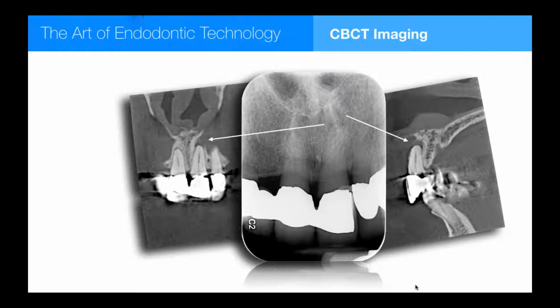Most of our patients now are having their orthodontics without 4x extraction to get that beautiful full arch form. It looks great, but what it means is if they didn't expand their palate, then these roots are outside the cortical plate. So we're going to have more challenges in diagnosing from conventional radiography than ever before. So it's a godsend to have this.